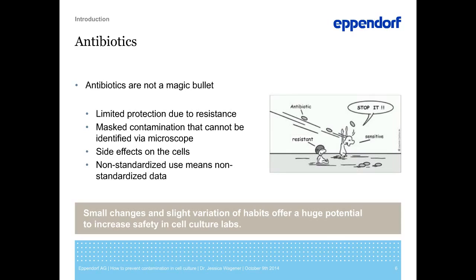Without antibiotics, most of the introduced contaminants would soon be visible under the microscope or even with the naked eye, as color changes or turbidity of the culture medium occur. The prophylactic routine use of antibiotics in cell culture not only masks poor aseptic techniques, it can also leave low levels of partially resistant contaminants undetected for longer time periods, and therefore creates a greater risk for the whole lab or facility.